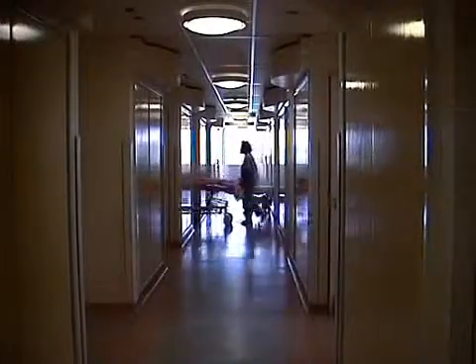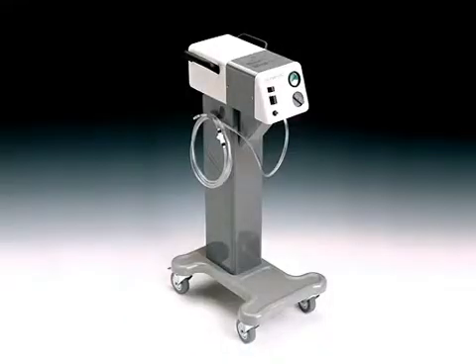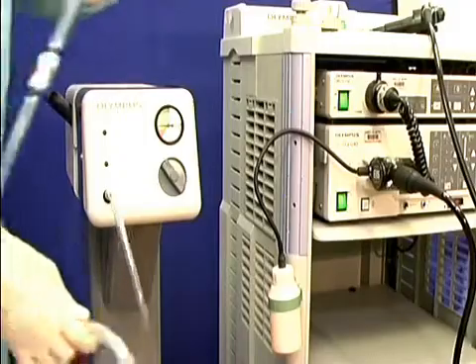Though carbon dioxide isn't used by many for colonoscopy, it should be. The equipment is available and easy to use. Give it a trial for your patient's sake.